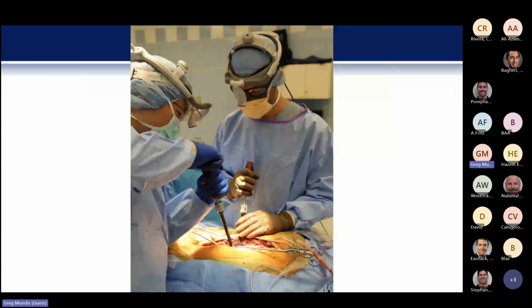The next part is placing screws. We're not going to talk too much about how to do this, except if you're doing it freehand, I like to do this by level. I like for each surgeon to be working at the same time, so you can triangulate your screws. I don't think you necessarily need screws at every level either, and these are things that you can plan out ahead of time, to skip screws in certain places where you may not necessarily need fixation, outside of the foundations and maybe across the apex on the concavity.